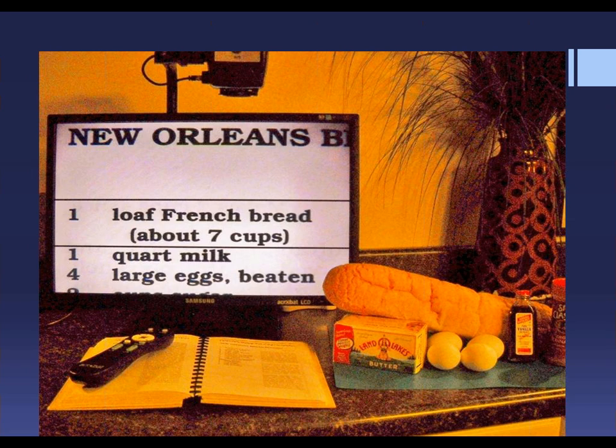These options are available through the remote control, which is laying there on the cookbook — that big black thing. I've set the background color as enhanced positive for a brighter look, and the black letters just seem to pop off the page. There are many other color options because, with low vision, contrast is so important. There's plenty of room underneath to work mixing and stirring your ingredients, and we highly recommend you begin to gather your ingredients for this New Orleans bread pudding before cracking the first egg.